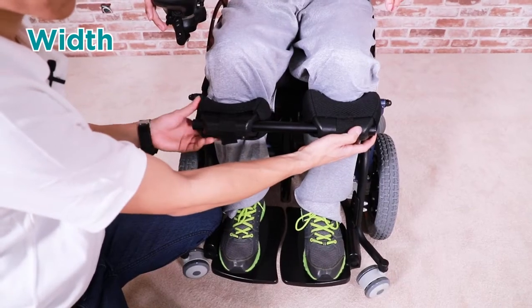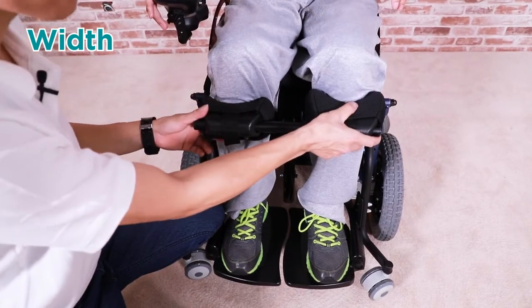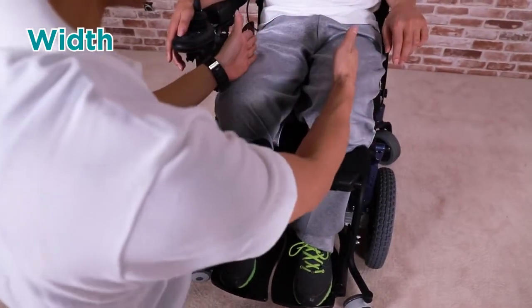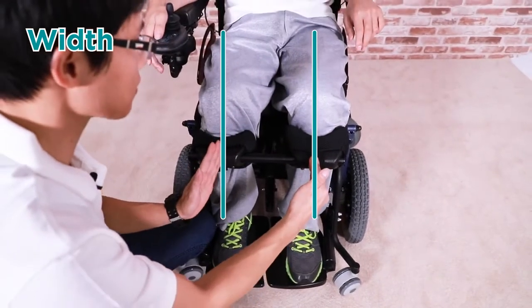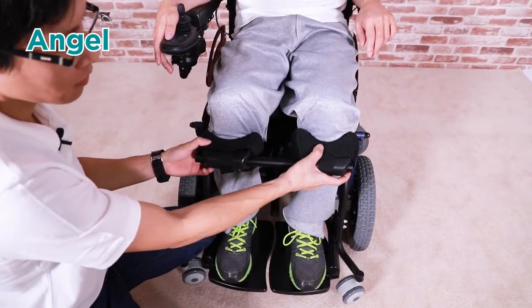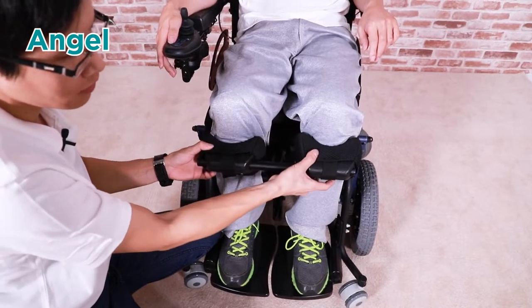Now, we adjust the width and the angle of the knee pads. The width is quite easy. Just draw a line from the user's thigh all the way to his shin. We want to align the pads with this line. With the angle, we want to find the angle of the pad that provides the maximum contact to the leg.